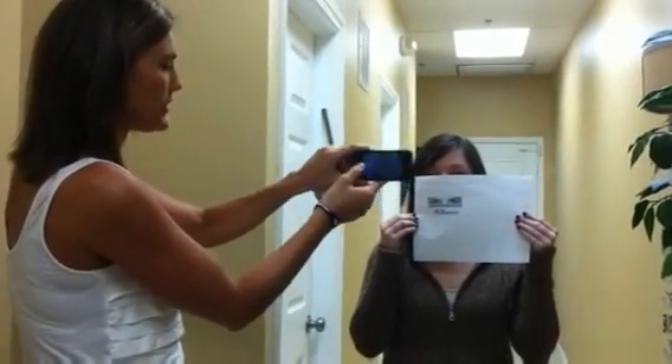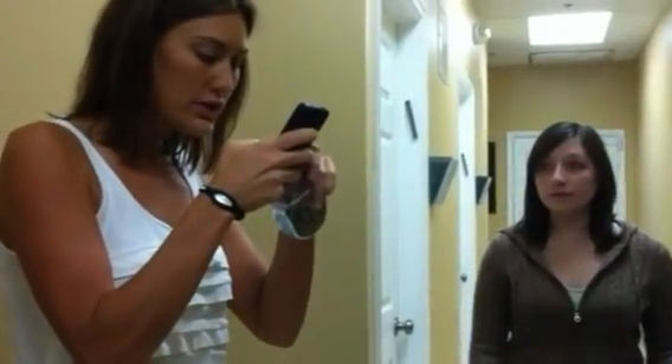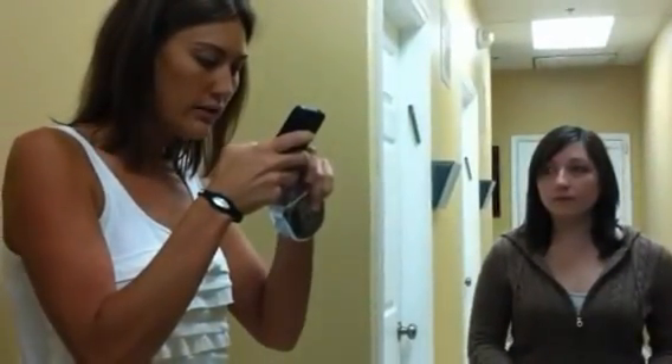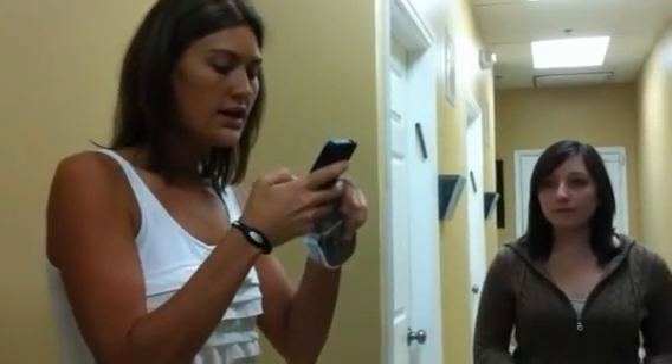So I am going to take a picture — perfect. And I will actually let you guys see how this picture came out with the ruler in the picture. I am going to look at it and it shows that she has a PD of 63 millimeters. I know that is actually right because our licensed optician measured her PD 10 minutes ago and he said it was 63.